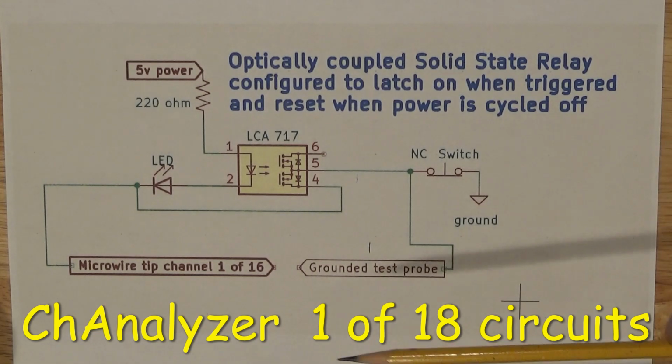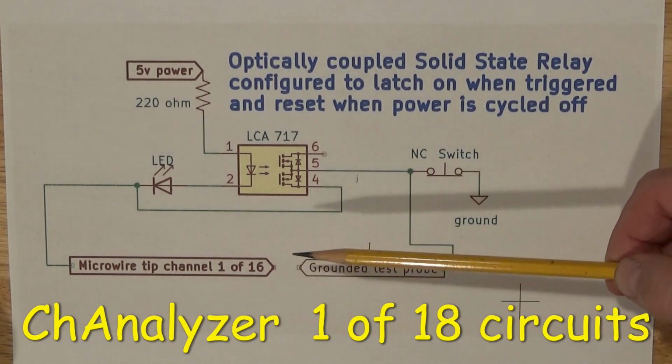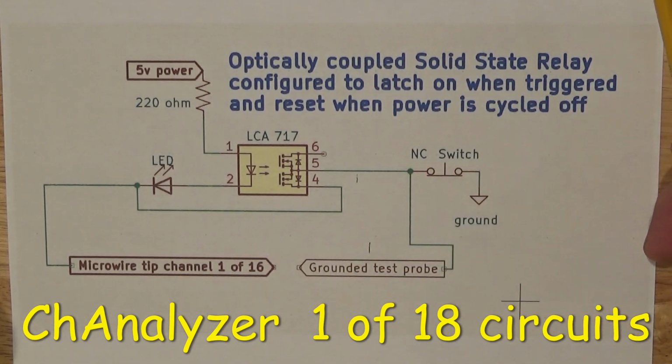And so you'd go through and work under a microscope, systematically checking each wire of the microelectrode, and looking up and recording which channel it is and sketching its location in the array related to the other 16 channels.